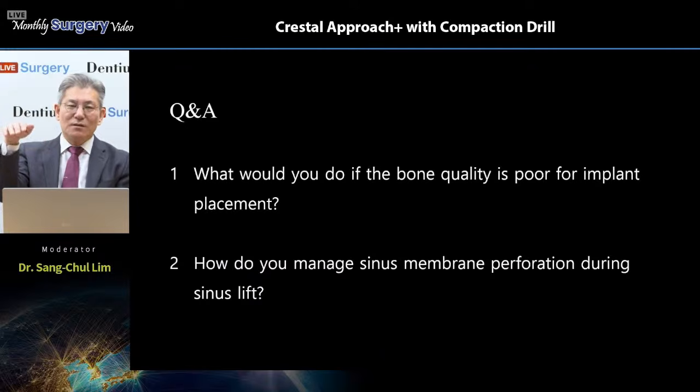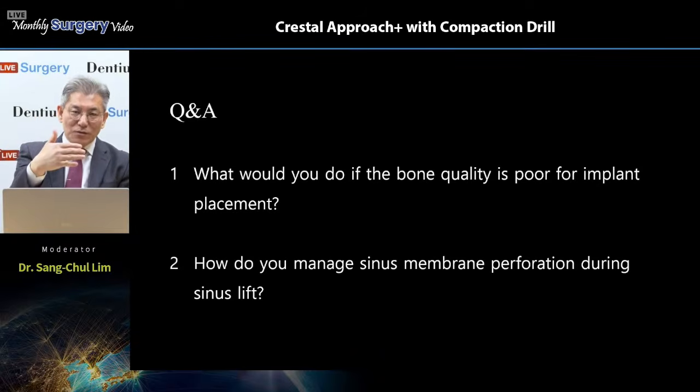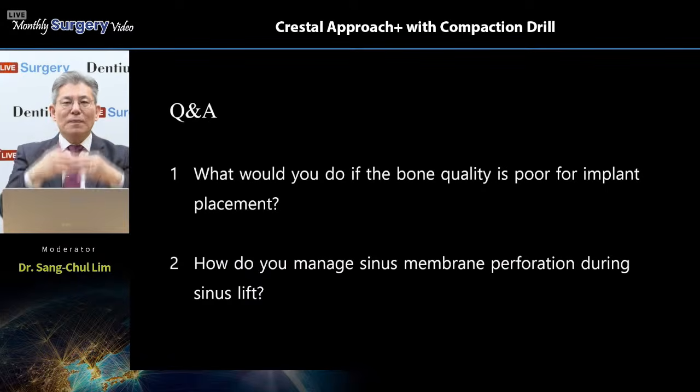The detachment goes a little bit more and more, and the approach to the perforated area, and then this perforated area is automatically elevated with the intact sinus membrane. After that, in a small perforated membrane case, the edges flip toward each other because of the reduced tension of the sinus membrane. So after that, we cannot see the perforated areas.